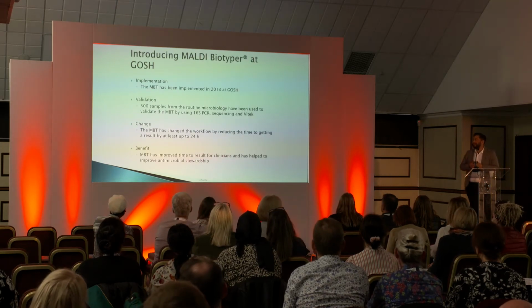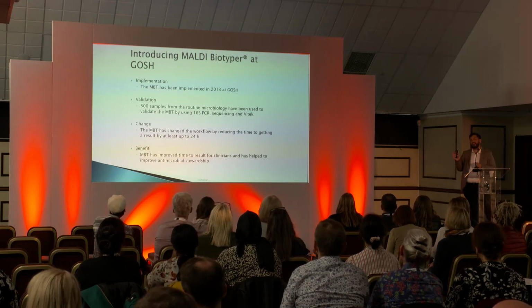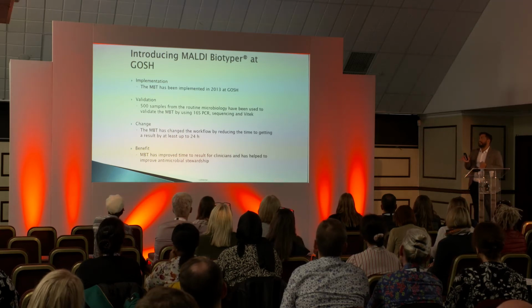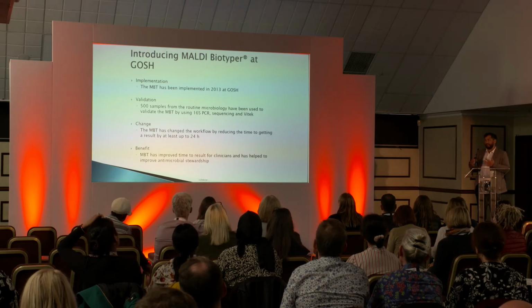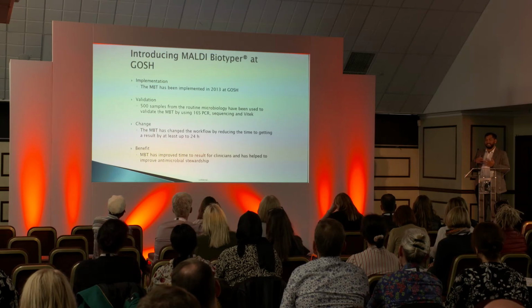Okay, so about the implementation of Maldi-TOF. This is kind of the same with any diagnostic instrument. Before you bring something into the lab, you need to check that it's fit for purpose. So we basically ran a number of known samples through it to check that we're getting the correct ID, that what we put through is what it says it is.